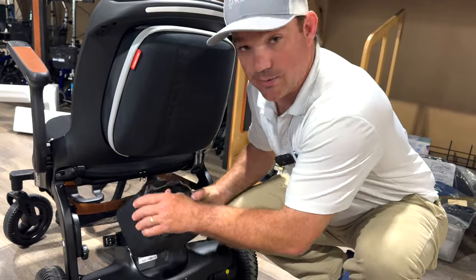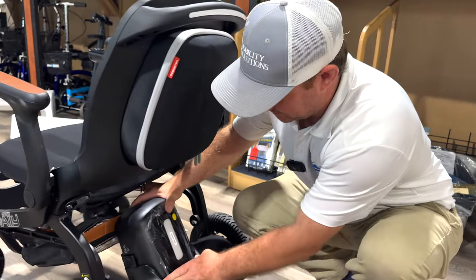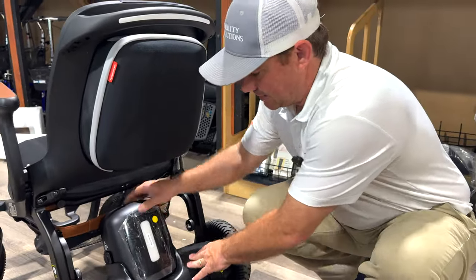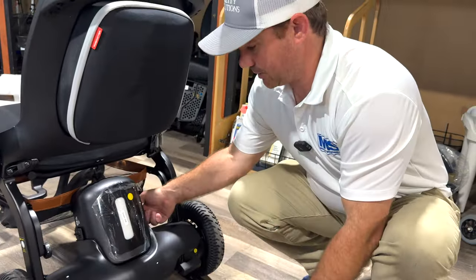Now, you can't do it the other way, so you'll see. Come here, on both sides you're going to do this. Lock, and then for some extra security, turn it to the lock, and turn it to the lock.